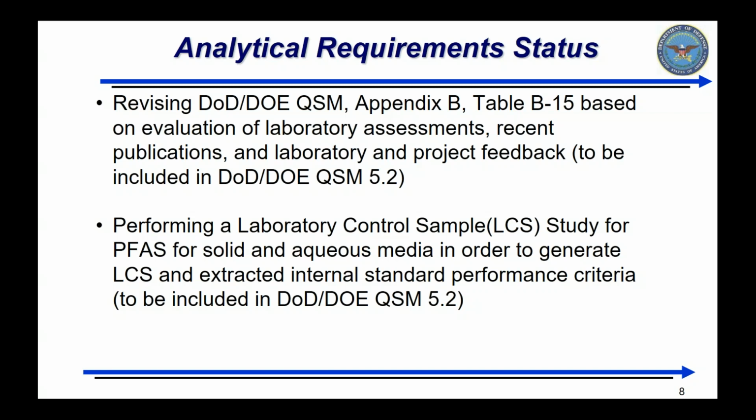In addition, the EDQW is performing a laboratory control study, LCS study, for PFAS in solid and aqueous media. This study will use data provided by the DoD ELAP accredited laboratories to generate LCS and extracted internal standard performance criteria. These criteria will be included in Appendix C of the next version of the QSM, and laboratories will be required to meet the criteria by the updated requirements of Table B15. So both the immediate changes we're making to the overall QSM, as well as specific to inclusion of a laboratory control sample study, are going to be included in the next revision of the QSM 5.2.